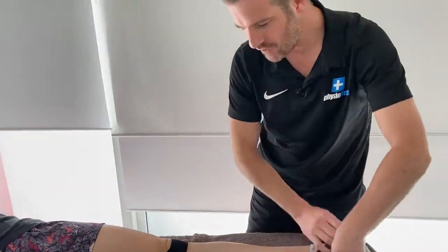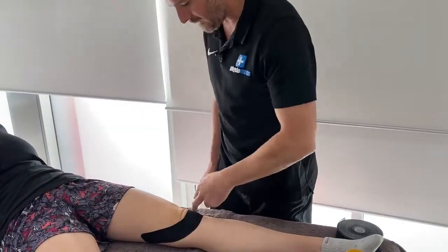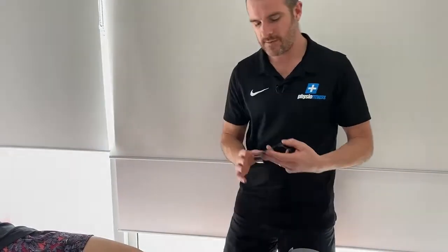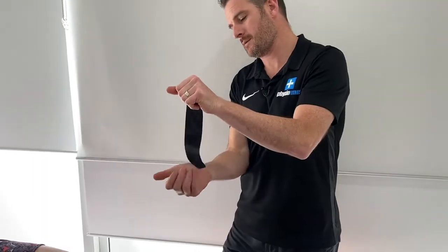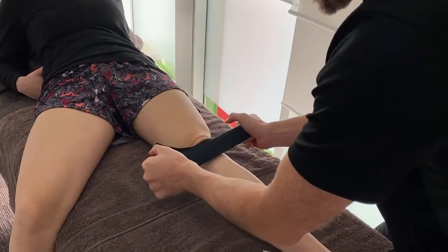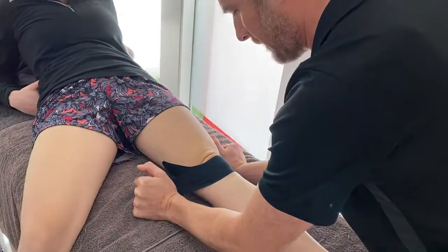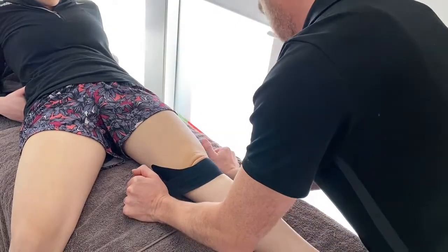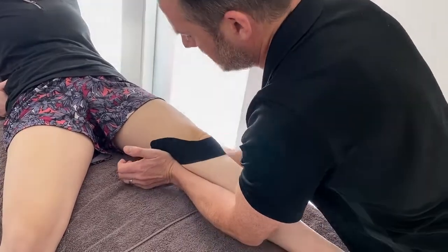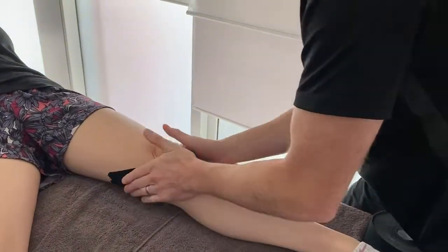The second strip is going to overlay the first. That first tape is your start point, but one tape is not enough. The second tape comes over the first as a grip, and with this one you can really go up to 100% tension. Same starting position, then come just a fraction under the first strip — if the first one is correct, come under it a little bit, and from there you can really get some power. Make sure you're not letting the tape curl — you don't want any of that. Come below the other one; you're almost coming on a bit of a drag anteriorly. Watch your anchors — about half of the anchor end is on the tape and half on the skin.